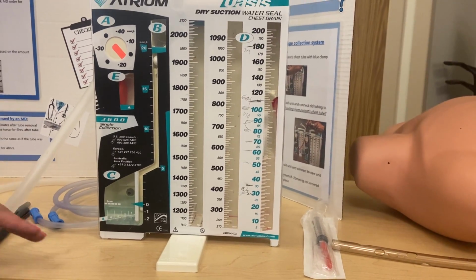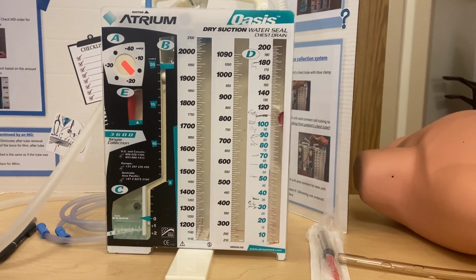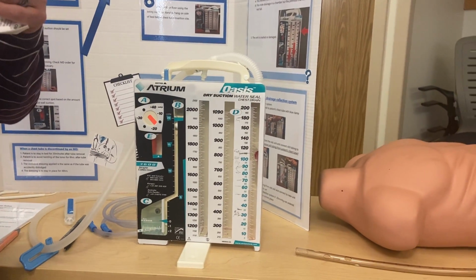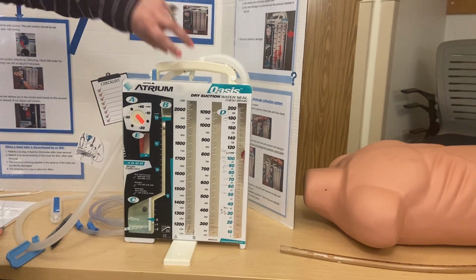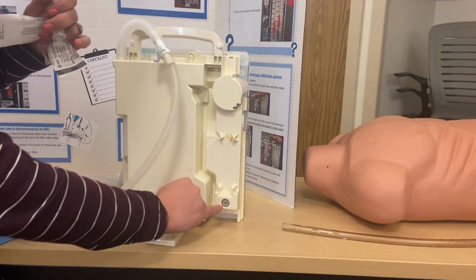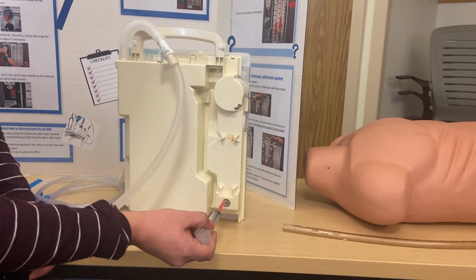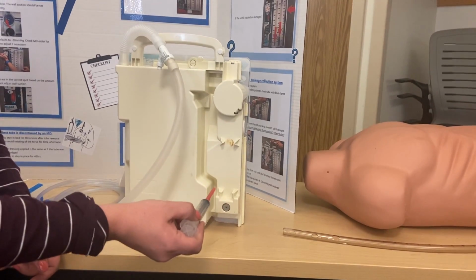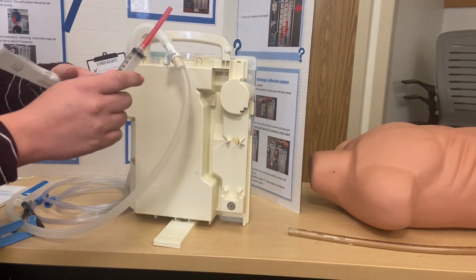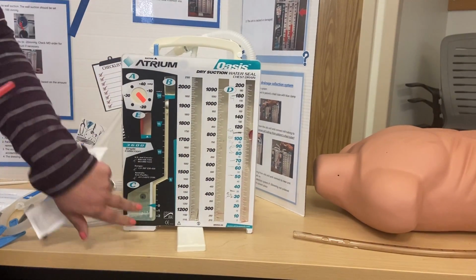If for some reason though you notice evaporation in the water seal chamber, what you can do is take a syringe, fill it with sterile water, put a needle on the end, and then turn this around. Clean this off with alcohol. This is considered the grommet, this little circular gray area. And you can put water in until you reach that 2 centimeter mark. You need to keep it at 2 centimeters because it's the perfect amount of water to create that water seal. Okay, so you have your water seal.